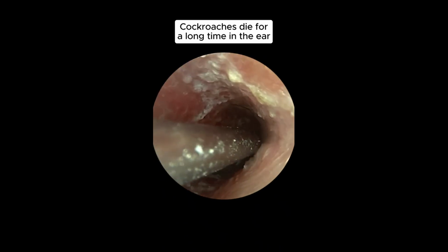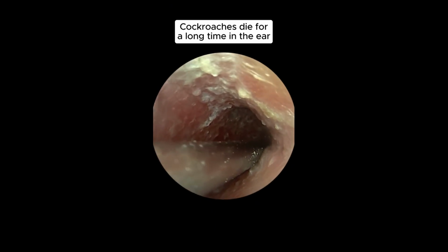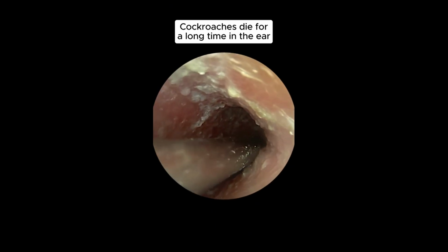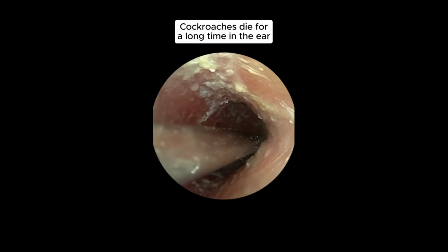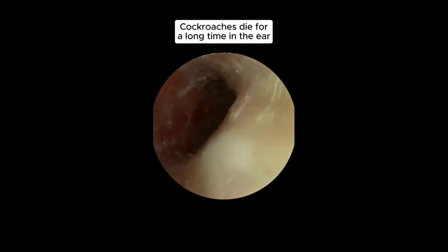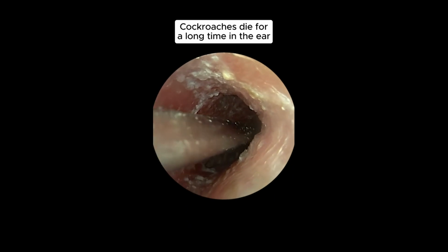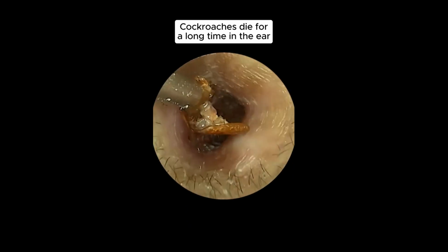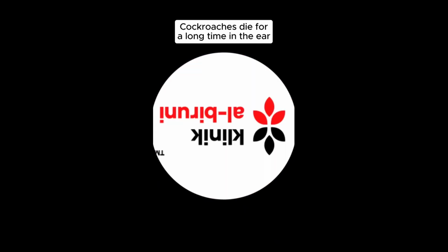That is, I guess, the attic or epitympanum, but in this particular patient, the scutum, the bit of bone that covers the attic, or covers the head of the malleus where it would be, that's gone. That is what was or is the posterior wall of the ear canal. So that's been left unaffected. Now, some people call that the facial ridge because the facial nerve is within that structure.